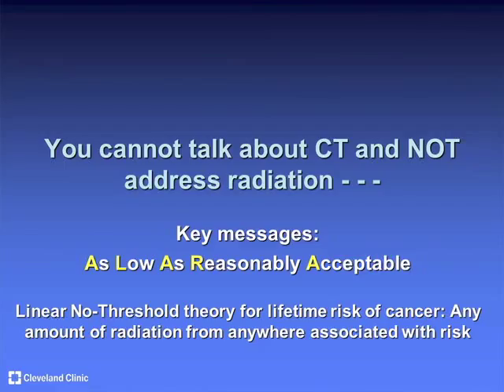You obviously cannot and should not talk about CT or nuclear without talking about radiation. The bottom line is no radiation is safe, and something is worse than nothing, and it should be kept as low as reasonably acceptable.